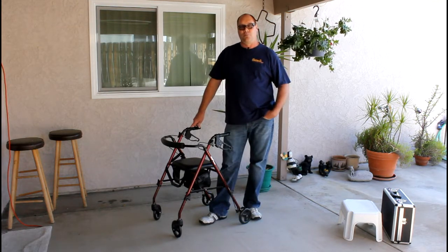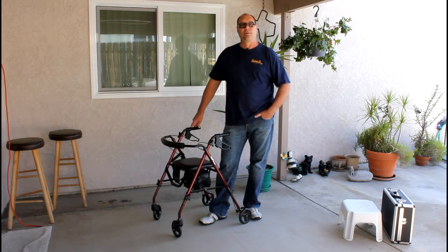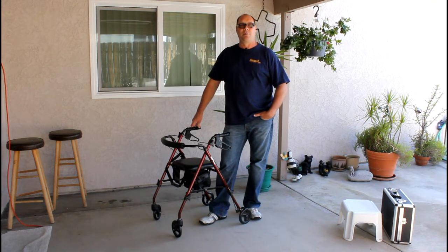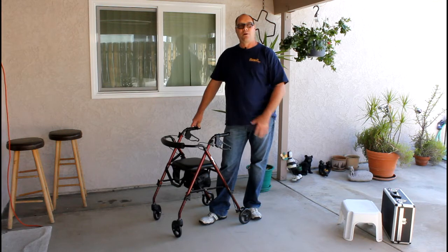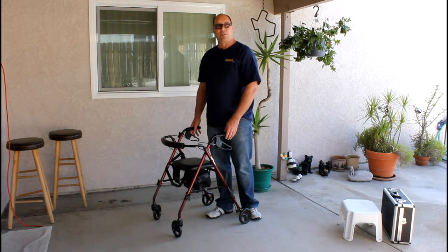When you approach a senior, this is a great thing to just walk up and say, 'Hey, how are your brakes doing? Have you had anybody check them lately?' That's such an open statement — they feel very invited. So they allow you to sort of take the walker and take control of the situation. It's very simple to check the brakes.